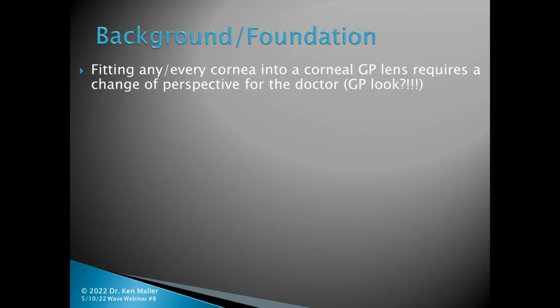All right, so fitting any or every cornea into a corneal GP lens requires a change of perspective for the doctor. And I'll never forget, this was going back quite a number of years. I had a consult for a doctor who sent in a case. I did the case, I sent back lenses, and then I received the single complaint from the doctor saying that the patient had a GP look when I was looking at them after putting the lens on their eyes. And I just had to follow that up to ask what's exactly a GP look. And so he answered me with, you know, where they can't open their eyes and tears are rolling down their face and they clearly are miserable and would prefer to be anyplace else.